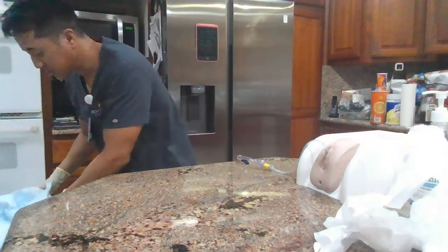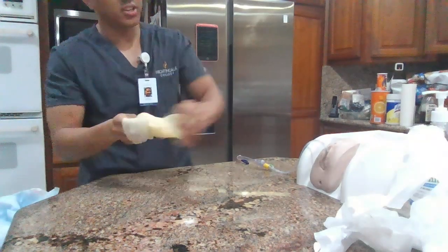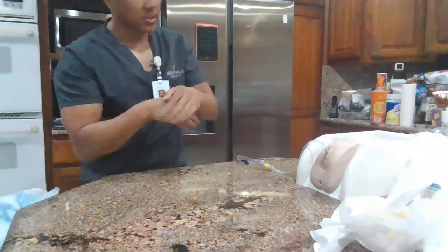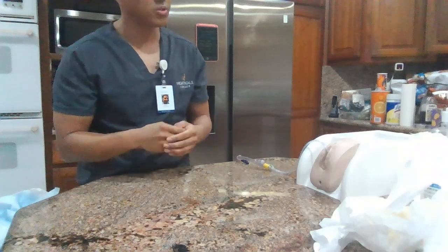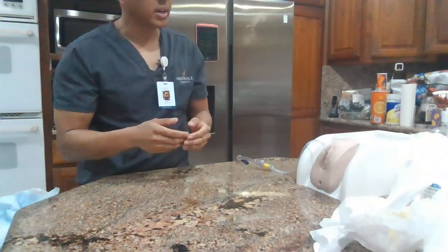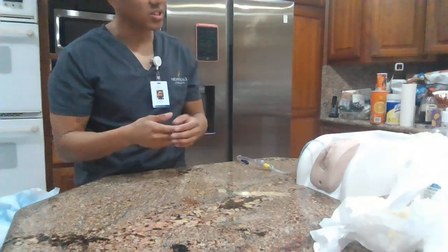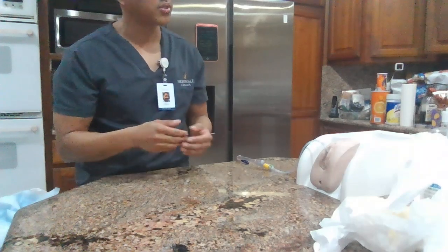So for now, I'm going to take off my gloves and perform hand hygiene. Okay, Mrs. Smith, please use the call light if you're going to get up and walk anywhere. And if you have any questions or feel any discomfort, please use the call light to get me.